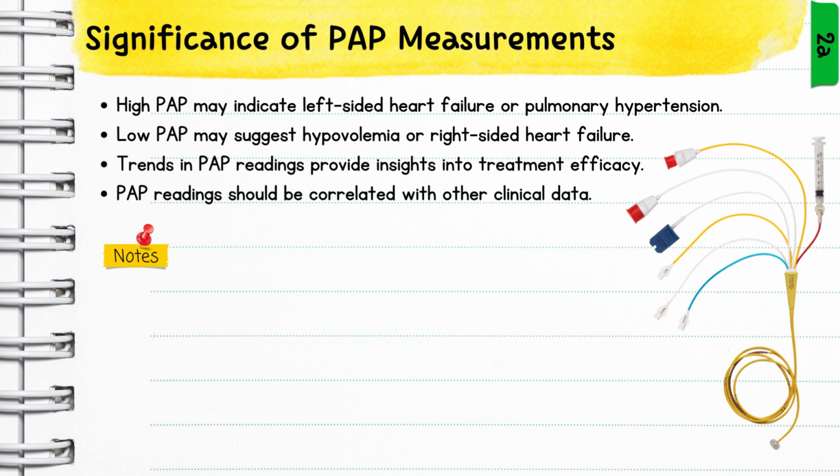Remember, pulmonary artery pressure readings should always be correlated with the clinical data and how your patient is looking. We're treating the patient, not the monitor. Okay.